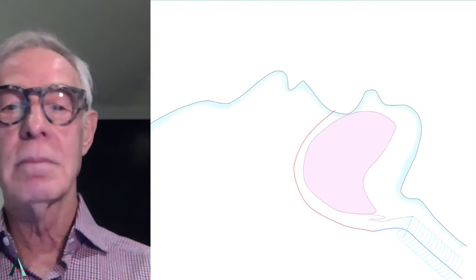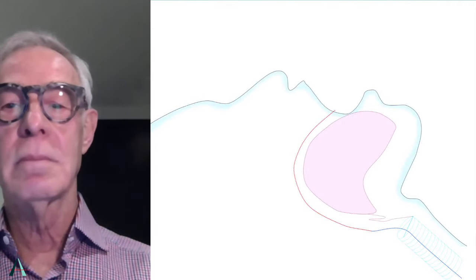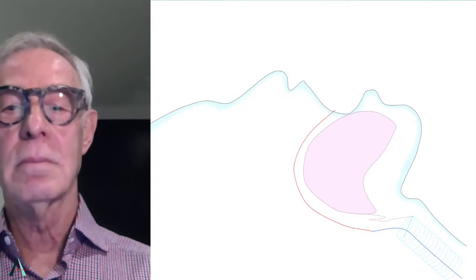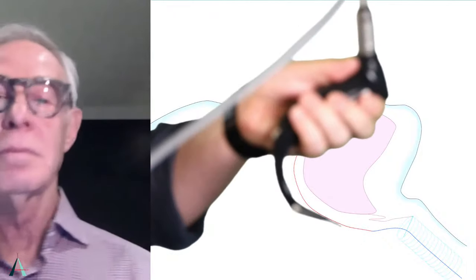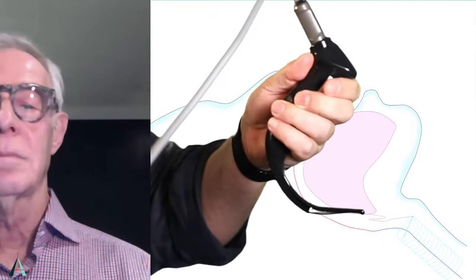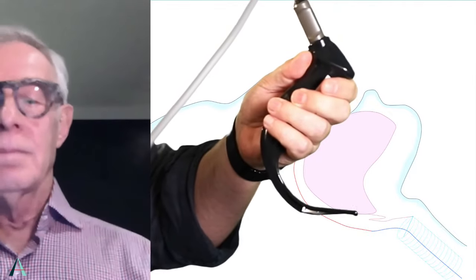So, Richard, I think you wanted to start by deconstructing the technique without it in a mannequin initially, and we'll just talk through some of the points. Right. So I did this little sketch that we'll put up now. You can see the sagittal section, and I've marked the red line there as the primary curve, and the blue line is the secondary curve. If I hold this up and try to get it to be roughly the right size, do you want to talk through what we should be doing with the blade?